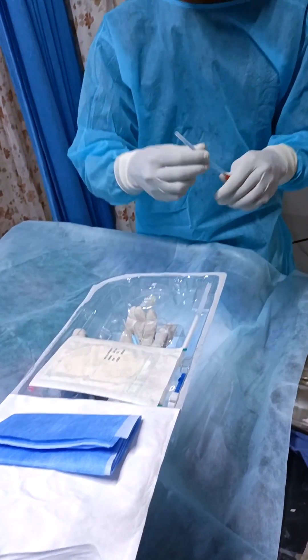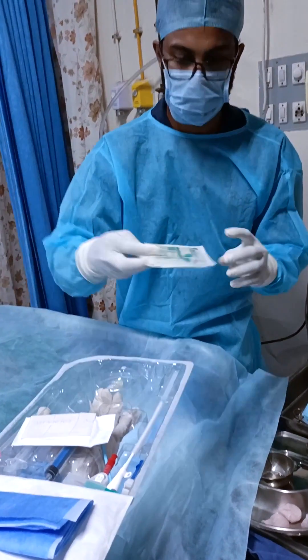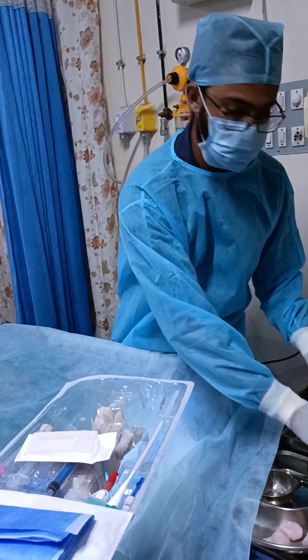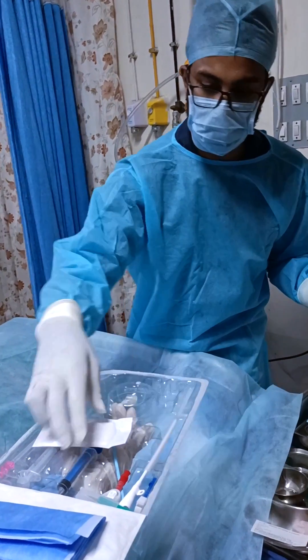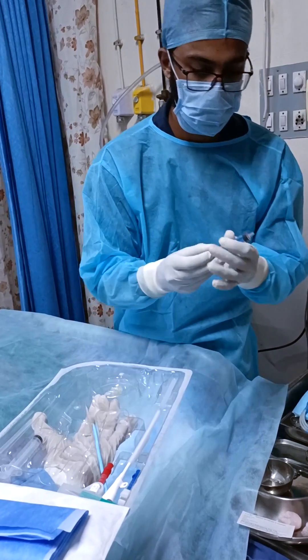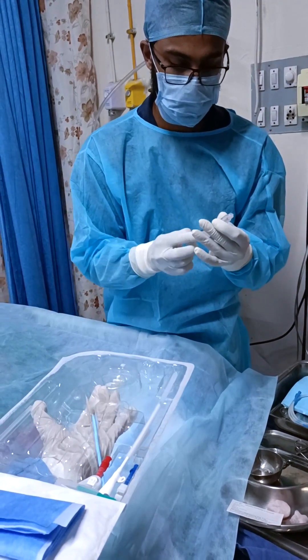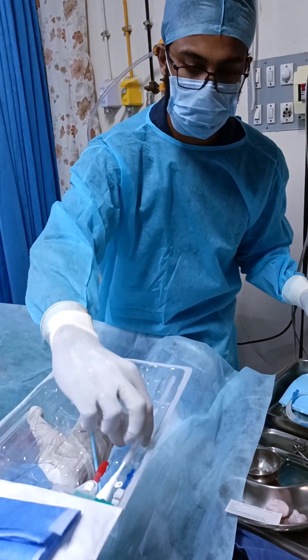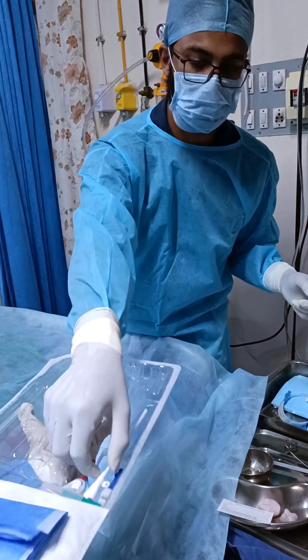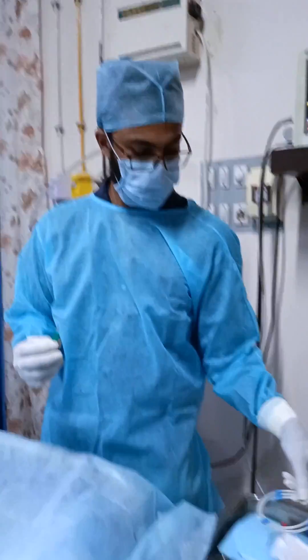Opening the HD catheter set, which has a dilator, suture material, a syringe for flushing, and that one right there is the HD catheter. This is the guide wire.